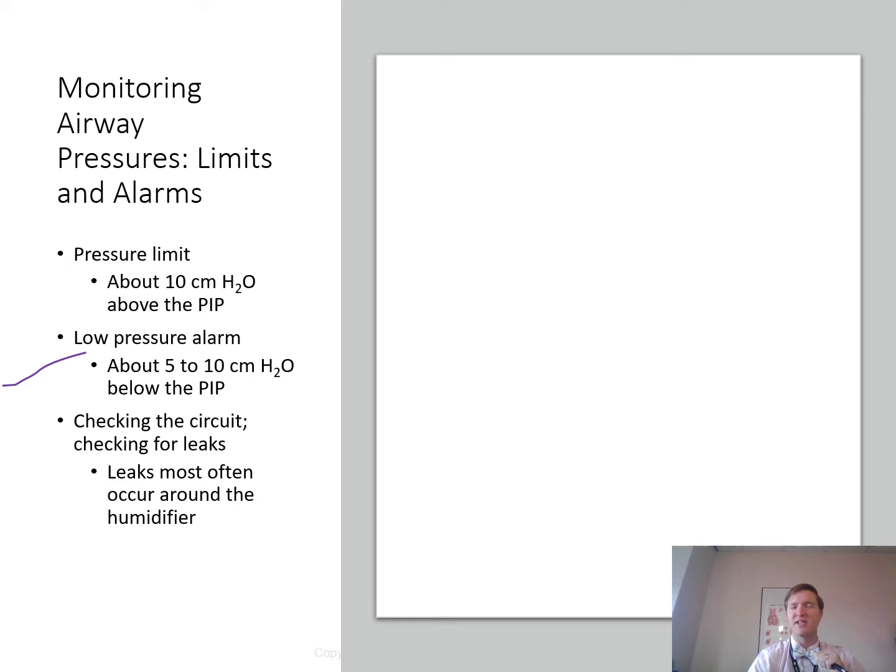You should check for leaks in the vent circuit, starting at the point where the circuit attaches to the ventilator outlet and working toward the exhalation valve, right? So before beginning this, it's prudent to make sure that the patient's being ventilated and oxygenated appropriately. So that's where you could either manually bag the patient and work your way through this. Therefore you might have to disconnect from the ventilator and manually ventilate, or have another person manually ventilate while you're trying to troubleshoot this.